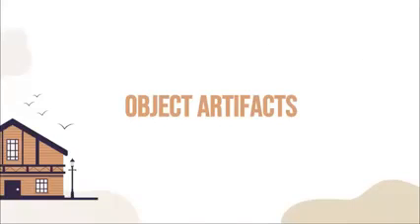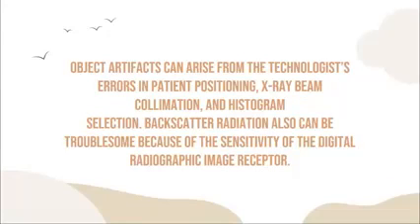So for the object artifacts, yeah. Object artifacts can arise from the technologist's error in patient positioning, X-ray beam collimation, and histogram selection. Diba? In histogram selection, you have to apply the specific lookup table para sa imong image na gamiton. For example, kumari si patient na ay prosthesis, diba? Naay murag tulo ka lookup table na gamiton. It's either type 1, type 2, or type 3. So dapat mag-match to sila.